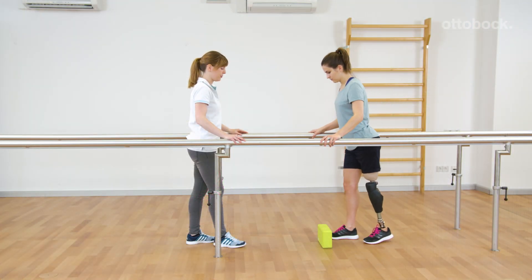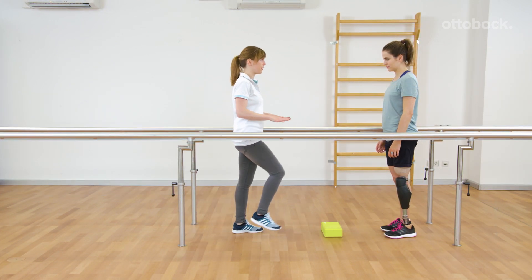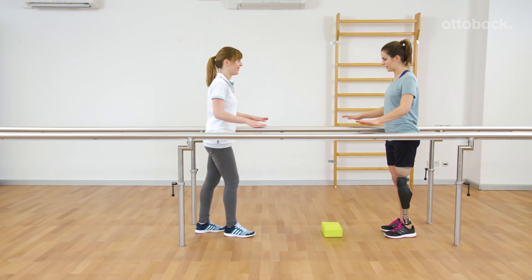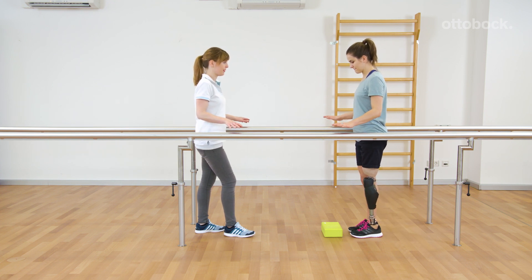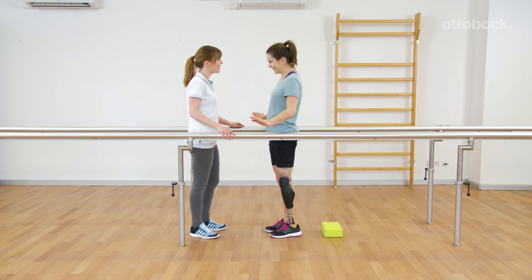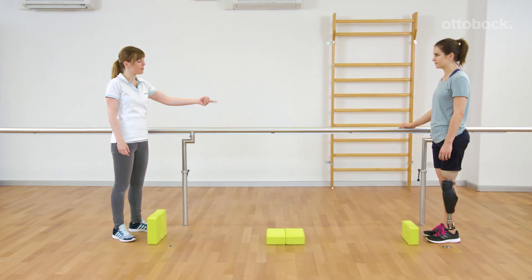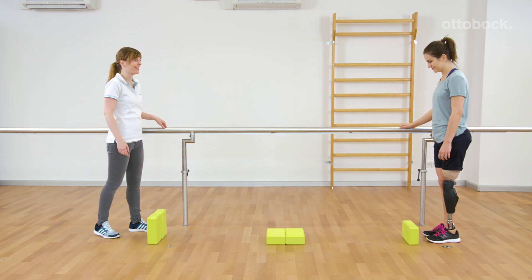Triggering the obstacle function out of walking or hands-free are already exercises with a higher demand. Furthermore, a few obstacles are placed simultaneously in a line. The distance and height of the obstacles can vary.